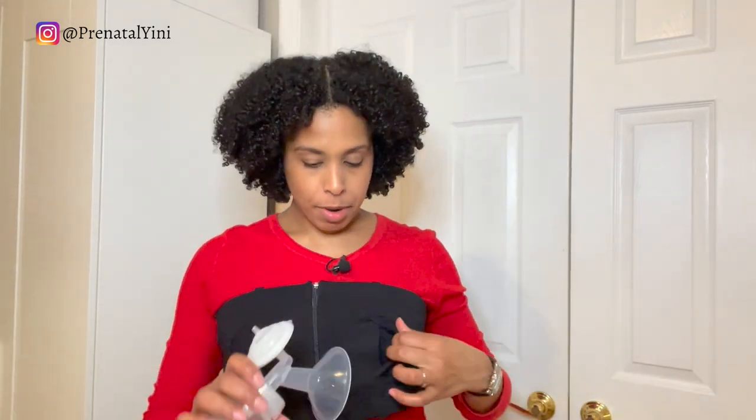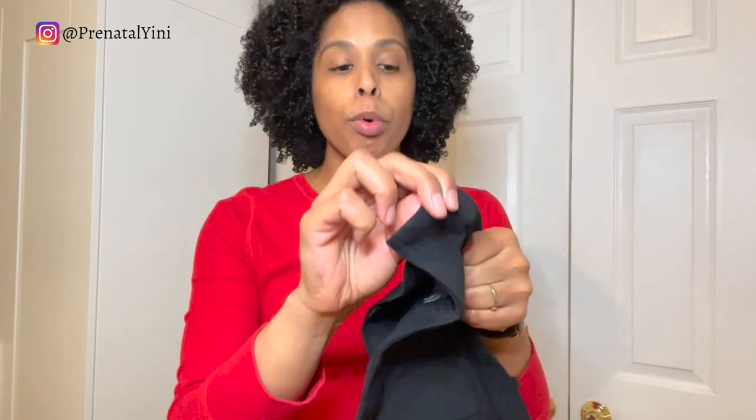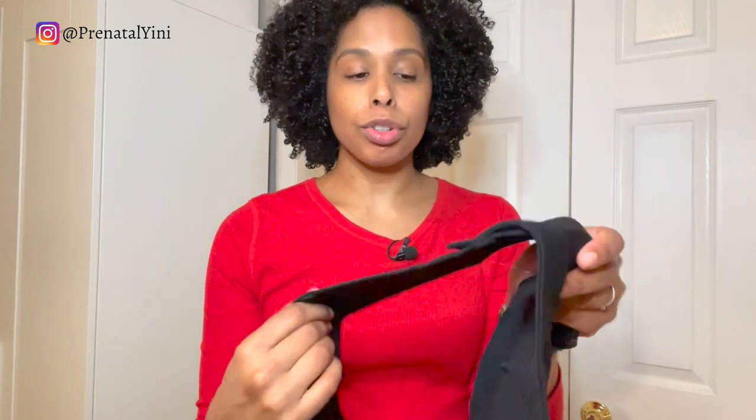It's a little snug but I can adjust it. This fits different sizes of flanges no problem and it will stay on. It also comes with a strap to wear it as a bra, but this one is designed for pumping. It has velcro in the back where you can adjust the size — you can make it smaller or larger based on your size.